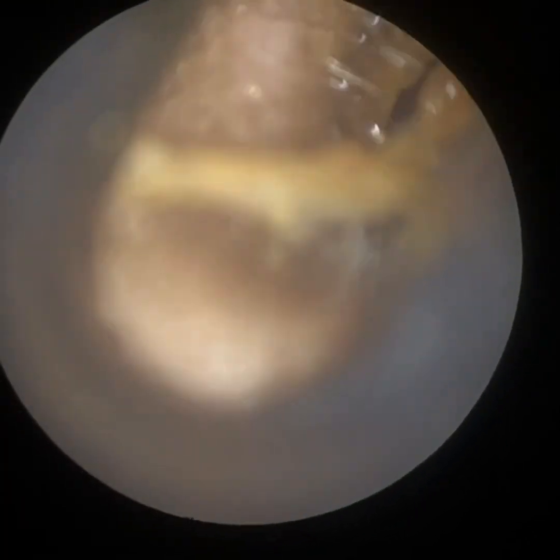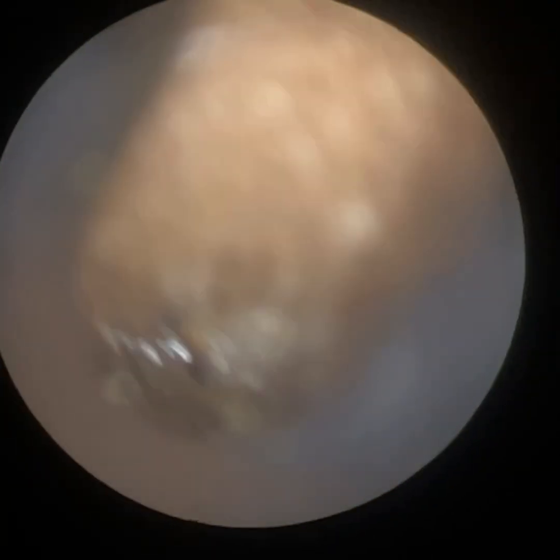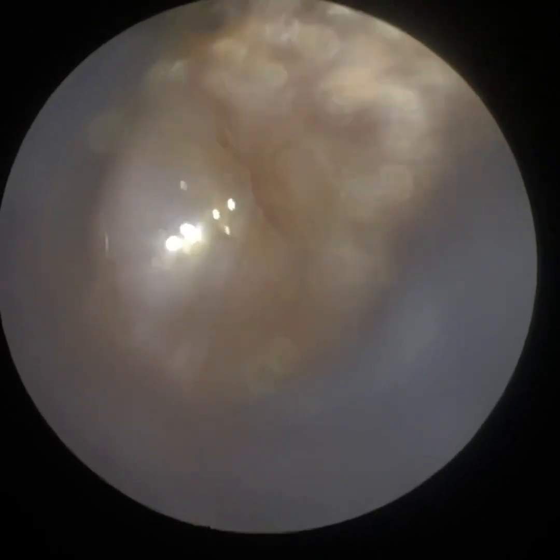With the Waxscope, because we've got the speculum attachment, it helps to stabilise the ear. We insert the speculum — we're using the 3.5mm one, our smallest size, and it's got a flared proximal end. You can see I've managed to remove all the occluding wax. That's the patient's eardrum — it's all intact.